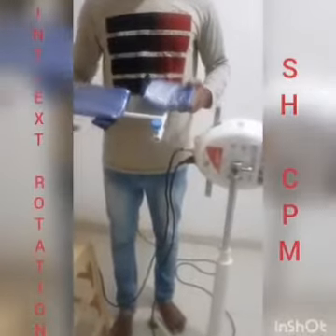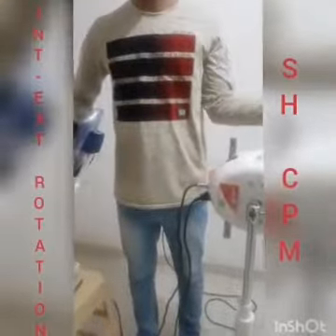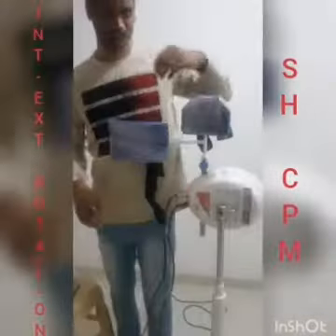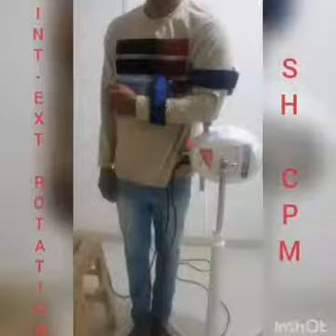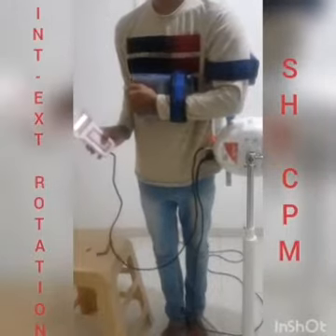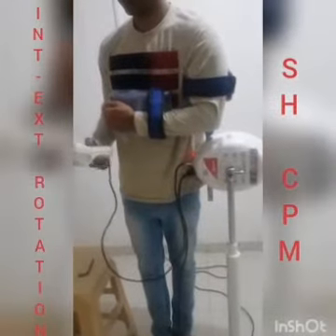Tighten it using the Allen key in such a way that the machine should not move any further. Use this splint for the internal and external rotation. Attach this splint over here on the machine head in this way and tighten it using the knob. Now, place the patient's hand in this way and tighten it using the belts. Set the required angle and treatment time in the remote, same as the other movements, and press next so that the treatment starts.